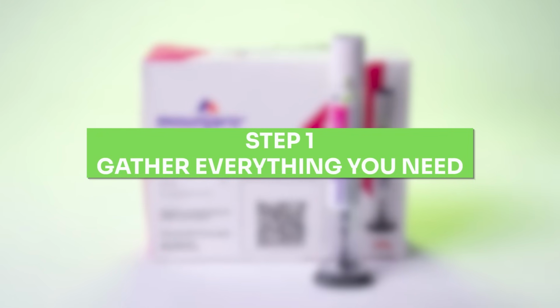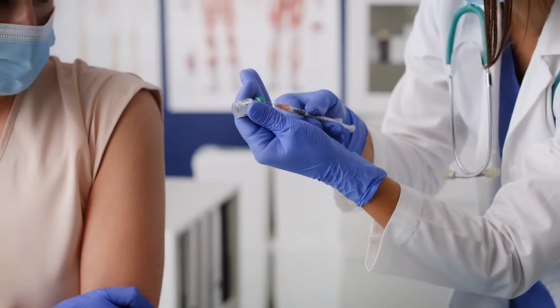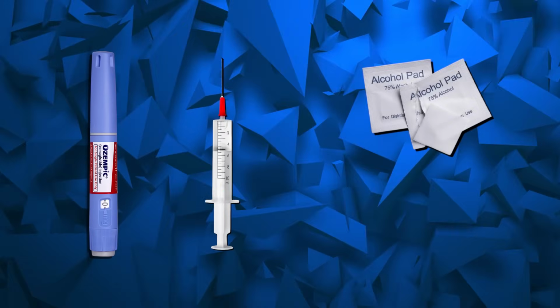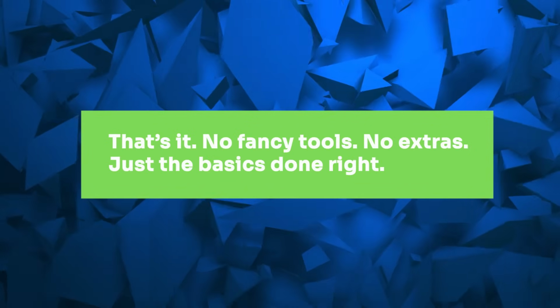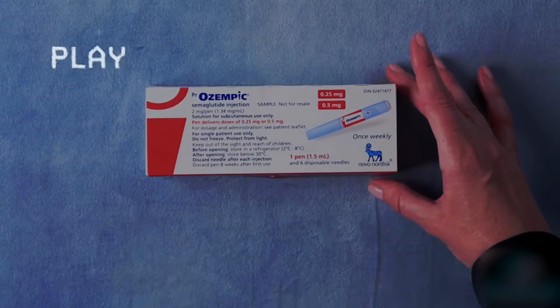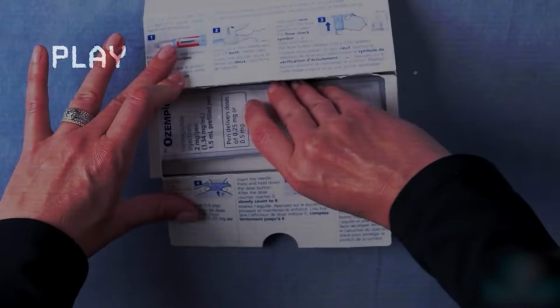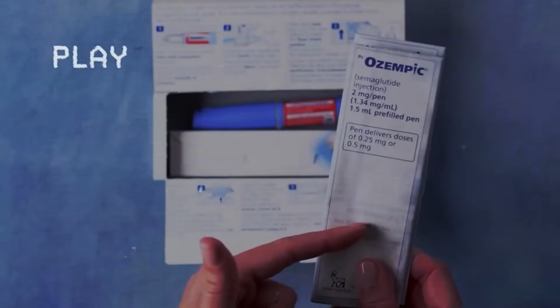Step 1. Gather everything you need. Before anything goes near your skin, you need a few things ready. A GIP or GLP-1 medication in the form of a pen or a syringe, an alcohol swab, and a container for used needles. That's it. No fancy tools, no extras, just the basics done right. So usually you'll start with the 0.25 or 0.5 milligram pen. So you'll open up your box, and inside there are inserts with lots of information on how to use your pen and how to dose it.